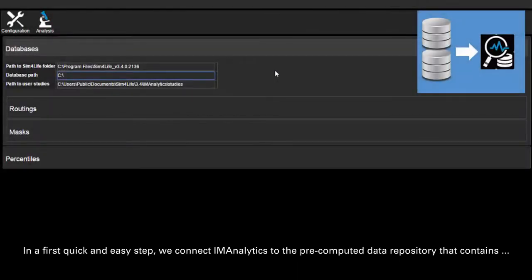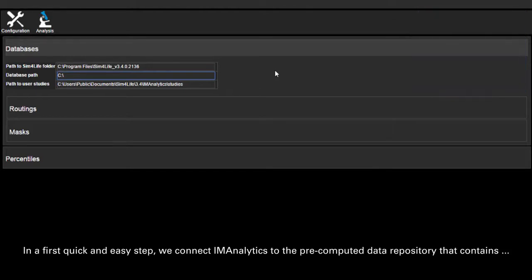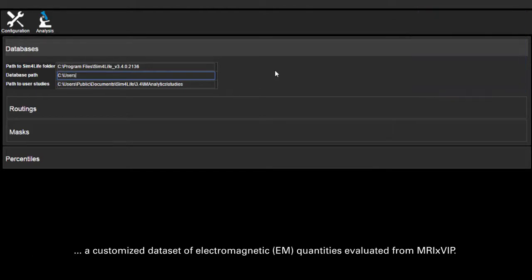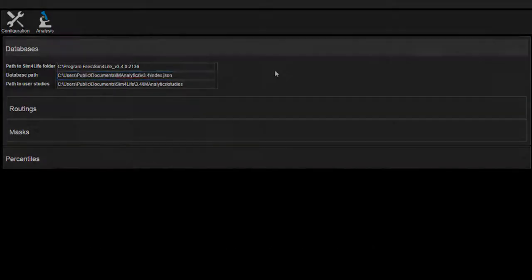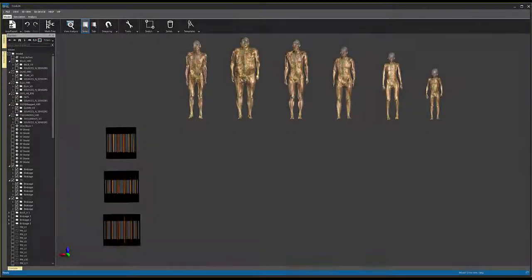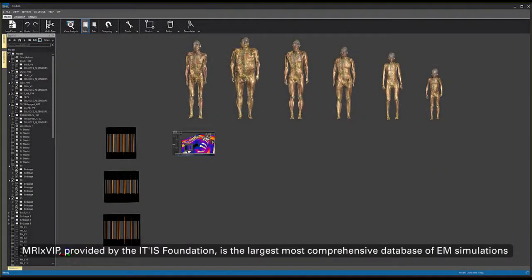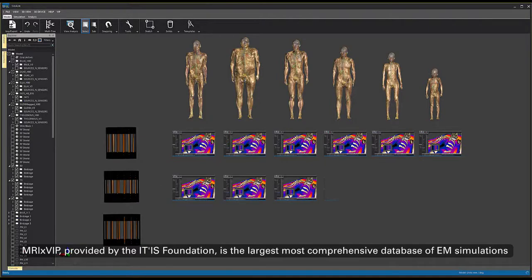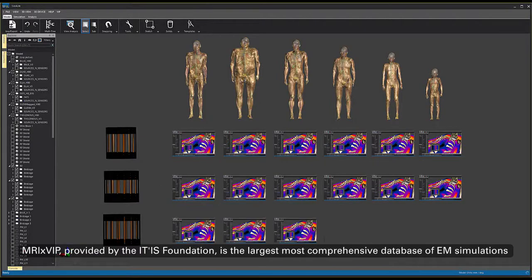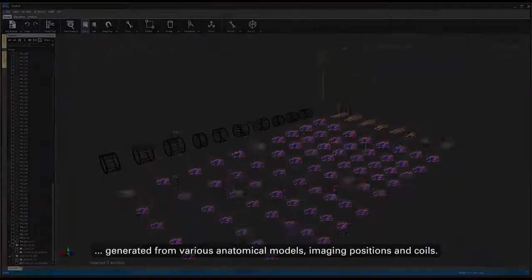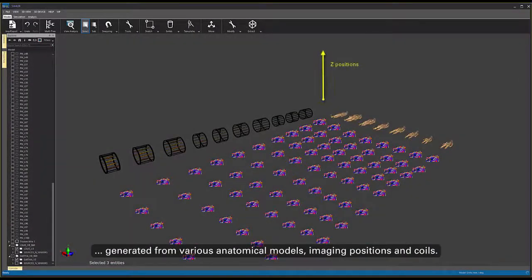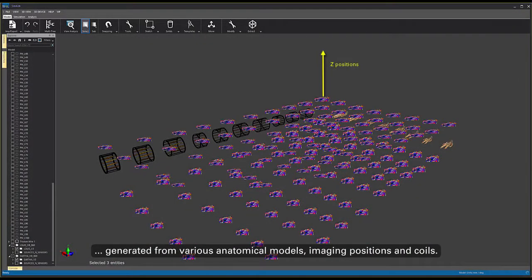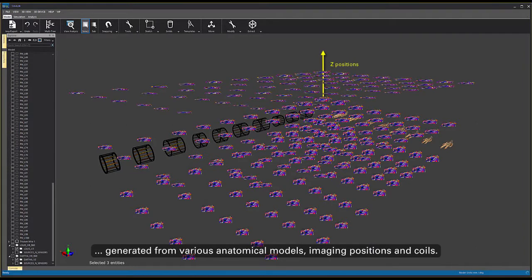In a first quick and easy step, we connect IM Analytics to the pre-computed data repository that contains a customized dataset of EM quantities evaluated from MRIxVIP. MRIxVIP provided by the IT'IS Foundation is the largest most comprehensive database of EM simulations generated from various anatomical models, imaging positions and coils.